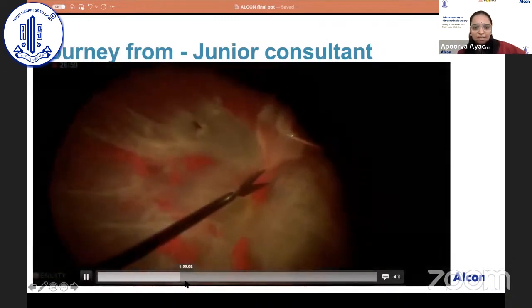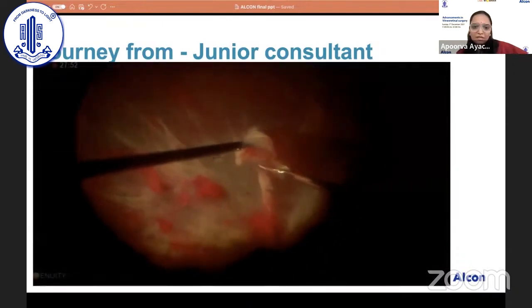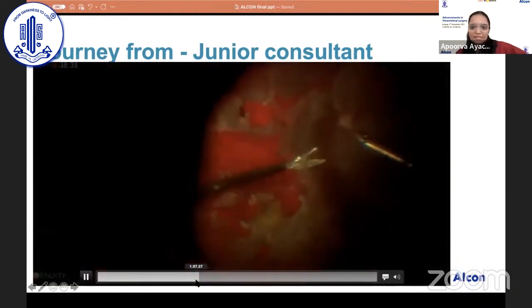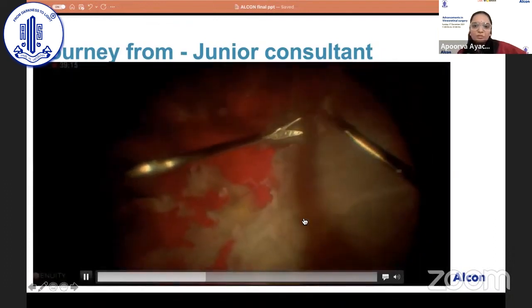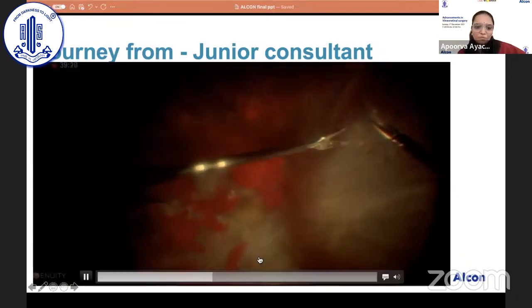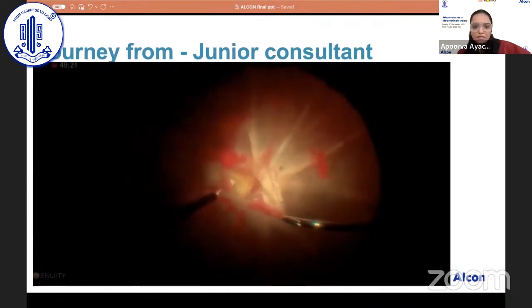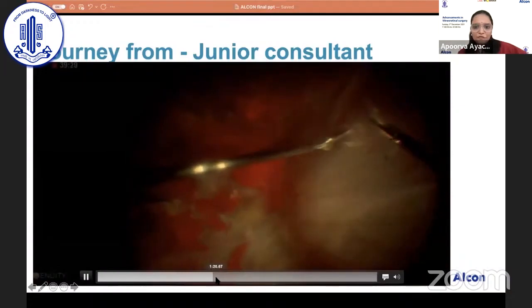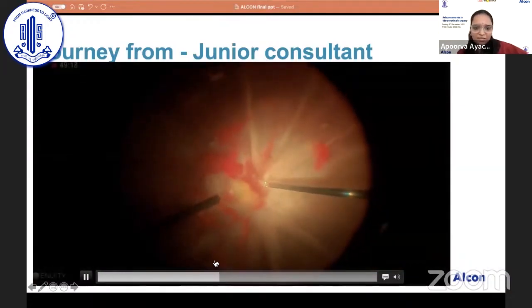As you'll see over there, this is a dissection that is going pretty well so far. But then somehow the retina doesn't settle. When I remove the membranes also, the retina should become more pliant. It should become a little bullous, at least in the areas where I have removed the membranes. But it was not happening in this case. It was as if the retina was stuck and had undergone some intrinsic kind of contracture.